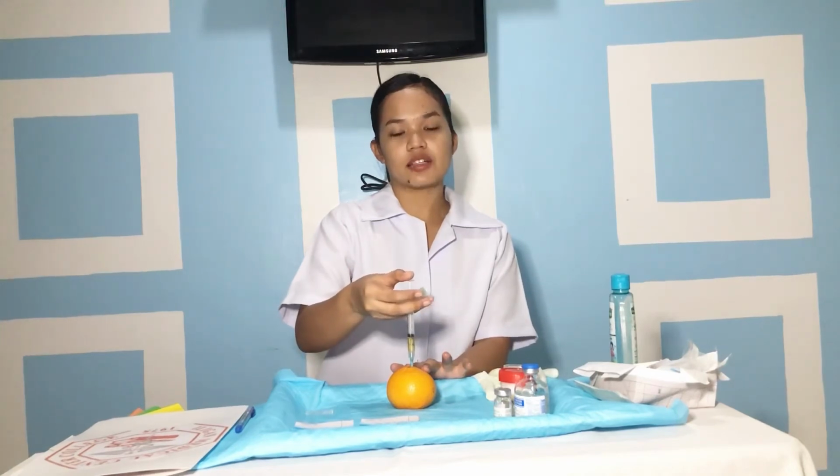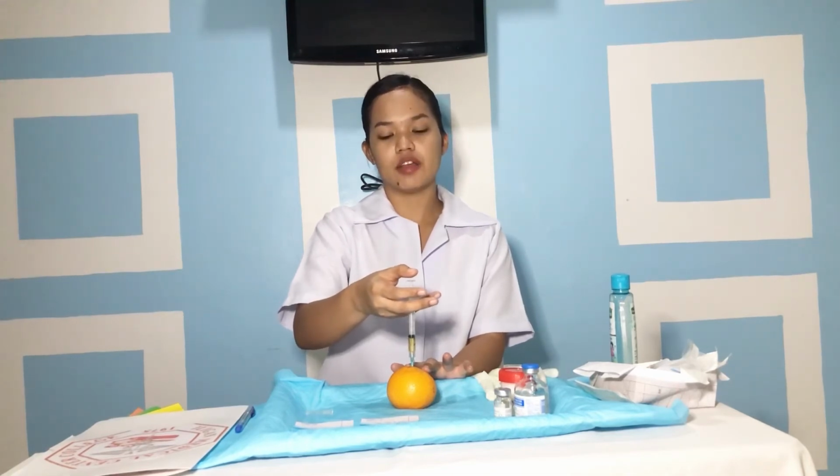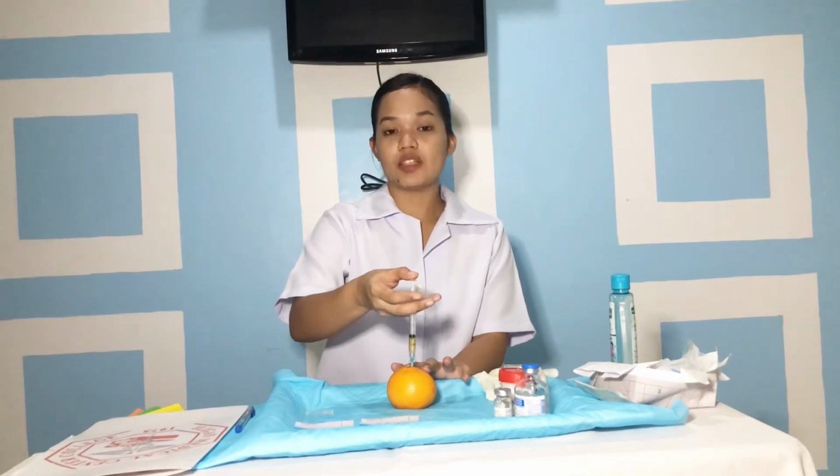So the skin in the Z-track creates a zigzag path through the tissues that seals the needle track to avoid tracking of medication. And then if the patient's muscle is small, grasp the body of the muscle between thumb and finger. So this will ensure that the medication reaches the muscle mass. So we insert the needle into the muscle with a smooth, steady motion.